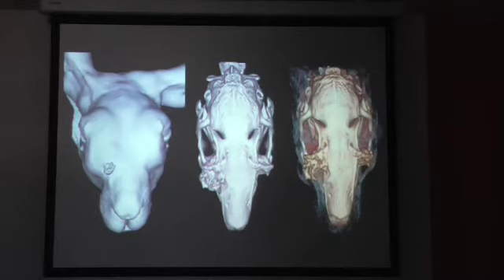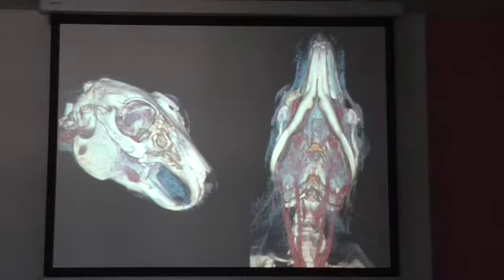And you could see here that there is a huge osteomyelitis of the cranial zygomatic arch. The problem is that the same thing, but to a lesser extent, was on the other side. So two surgeries are necessary. This is the same rabbit; you could see huge osteomyelitic lesions with resorption of the bone here.